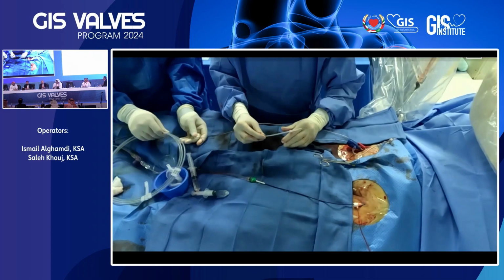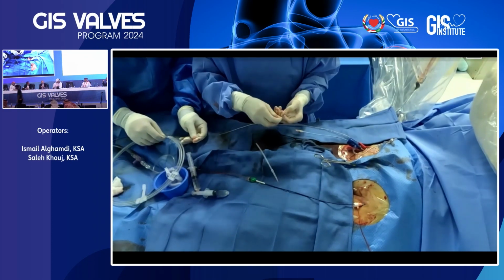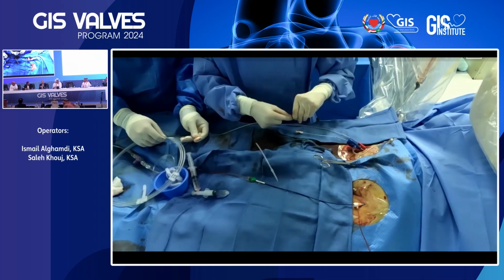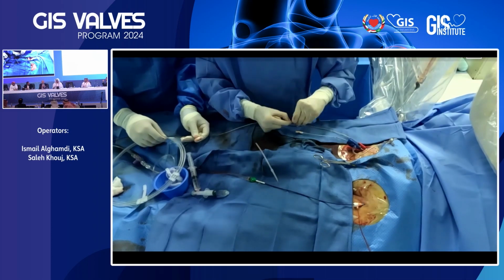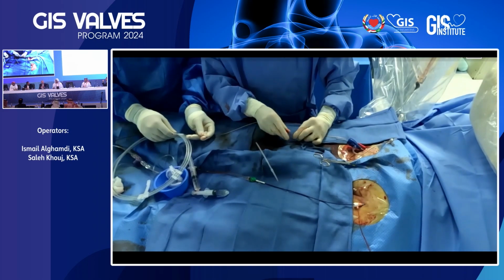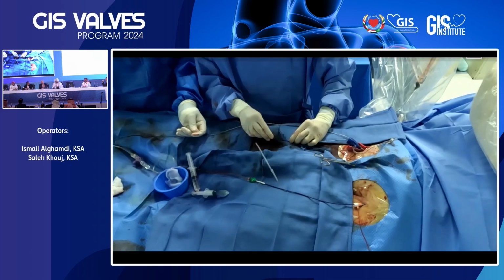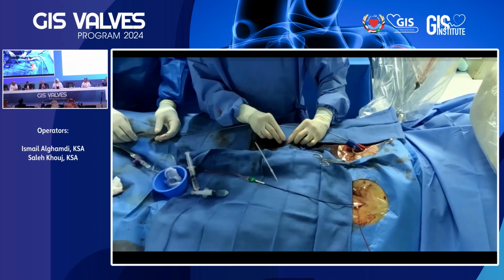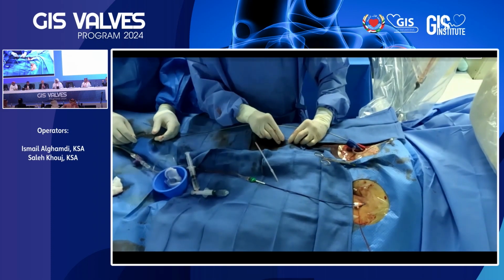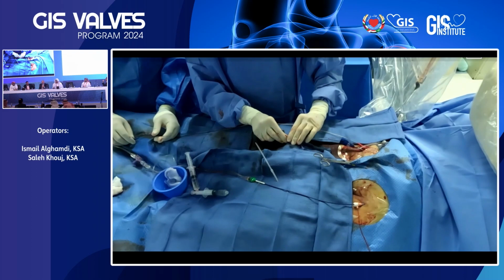So this patient, to put it all together, has low flow, low gradient, severe aortic stenosis, with ejection fraction higher than 50. This is called paradoxical low flow, low gradient, severe aortic stenosis. And this is as important as the true aortic stenosis that we're all familiar with, if the measurements are all done correctly.